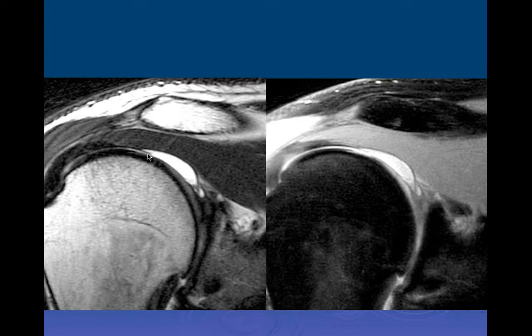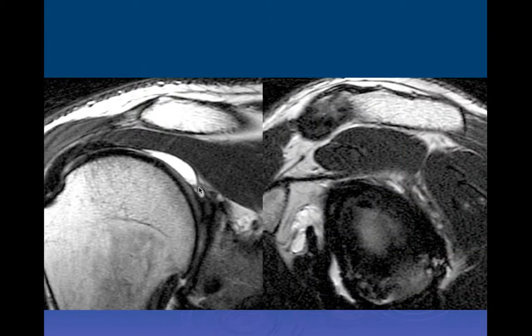What is this? Well, the question is, where is this fluid collection located? If it were in the joint space, you wouldn't expect it to be a focal collection here, right? Right. So the question is, what is that? Here is the sagittal image, and we can see there's a little something right in here.